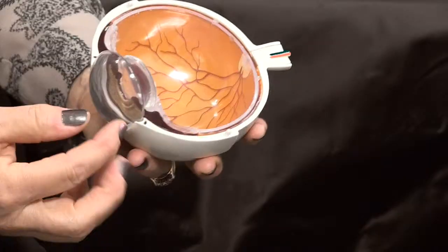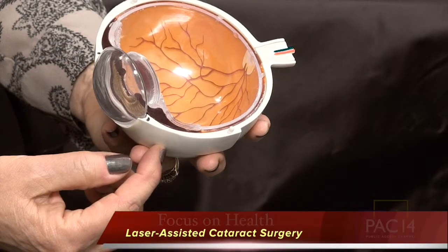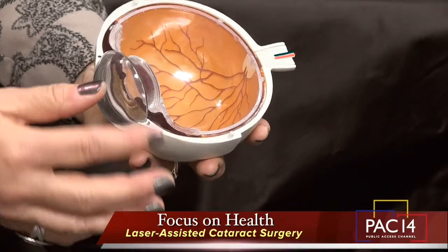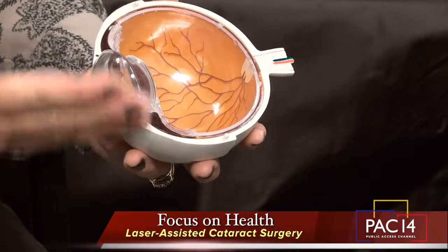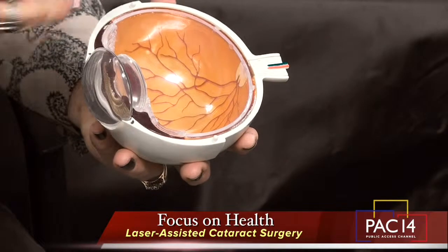We make a small incision in this cornea using a blade. Through that small incision, we go in and manually open the capsule to remove your cataract. And then we use a machine that breaks that cataract up into pieces for us to remove. That machine requires energy to do it. That's called phacoemulsification. And we remove that cataract with that energy.